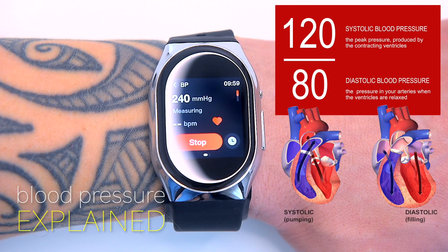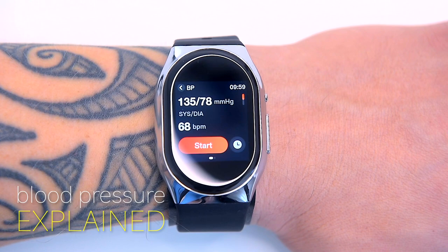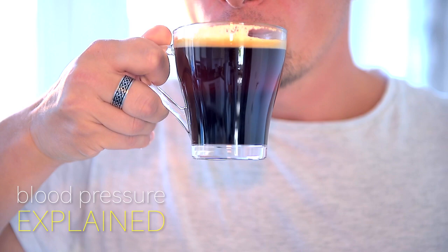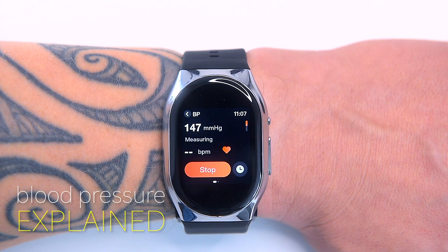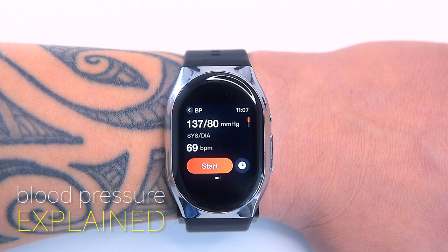The reading here is 135 systolic and 78 diastolic — that's actually elevated blood pressure; I should probably drink less coffee. Elevated blood pressure doesn't mean hypertension yet. However, if your blood pressure is around 140 by 90, that means you have high blood pressure, also called hypertension, and you should consider a reliable home blood pressure monitor. You can have high blood pressure for years without any symptoms, and uncontrolled high blood pressure increases your risk of serious health problems, including heart attack and stroke.